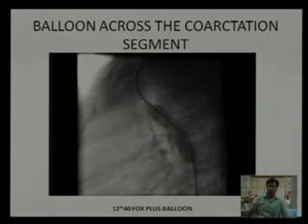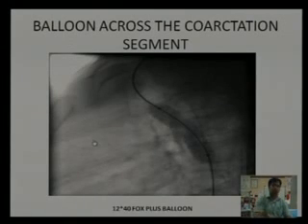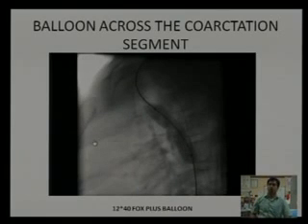So after discussing with Dr. Saibal Kar and all, we thought there is maximum obstruction at the upper level. If we relieve that, there will be relief in the symptoms. And second, lower down it's very difficult to approach at this moment because there is involvement of the right renal artery also. So we thought we'll go ahead with the balloon dilatation, we'll see the results, and if the results are good and satisfying, we can go ahead with the stent.